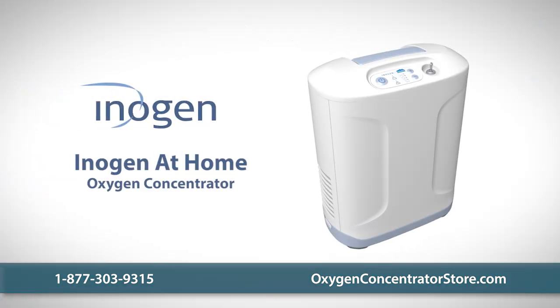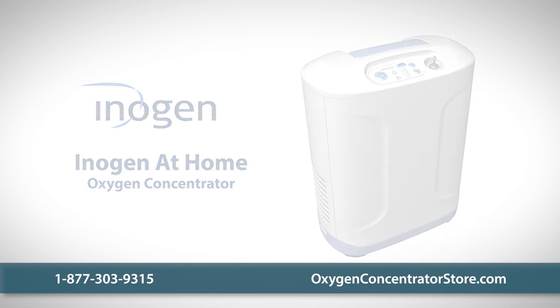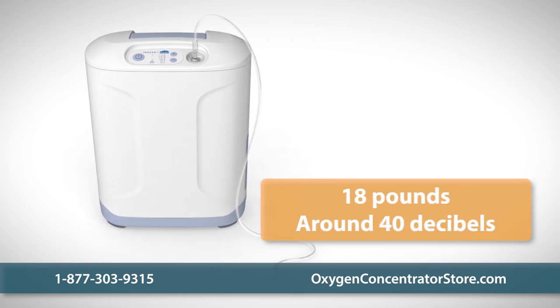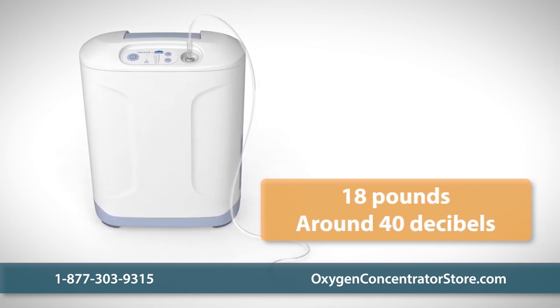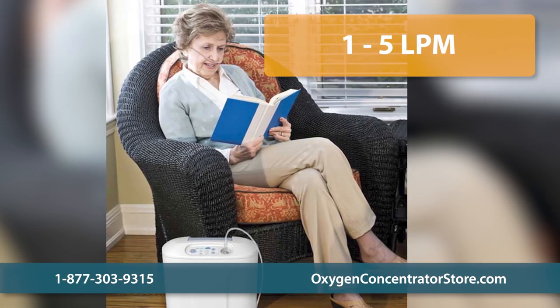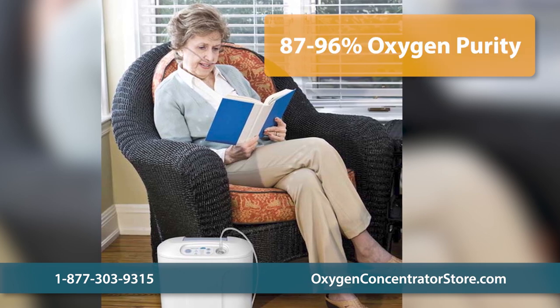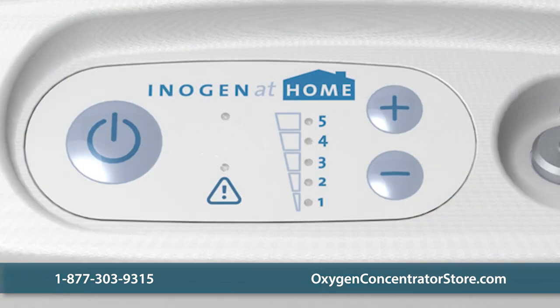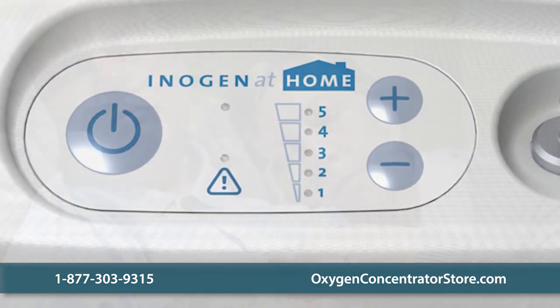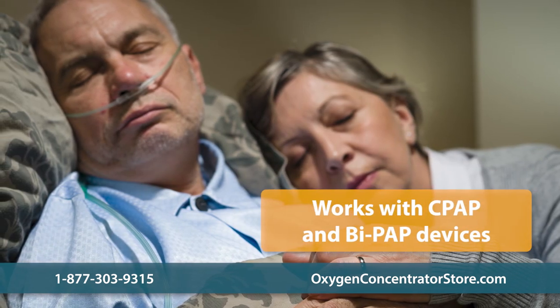The Inogen At Home oxygen concentrator is the smallest and lightest stationary concentrator on the market, weighing only 18 pounds and quieter than a refrigerator. The Inogen At Home is designed to be discreet and easy to transport. The unit features five flow settings ranging from 1 to 5 liters per minute with an oxygen purity between 87 and 96%. The simple three-button control panel is easy to use and the unit is designed to fit any user's needs, even those who require CPAP or BiPAP devices.